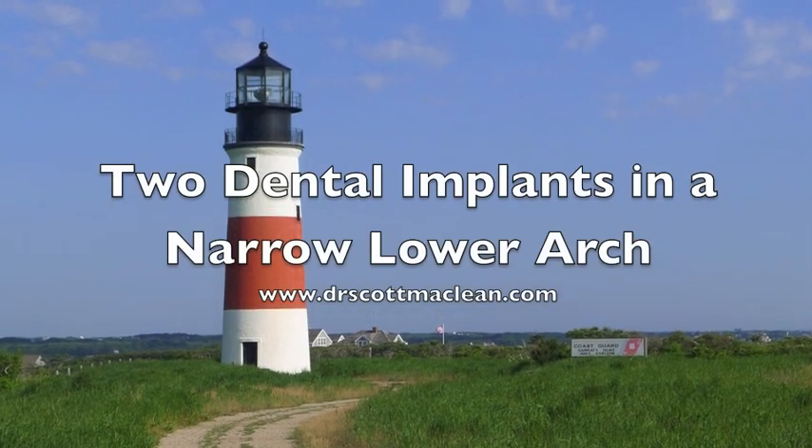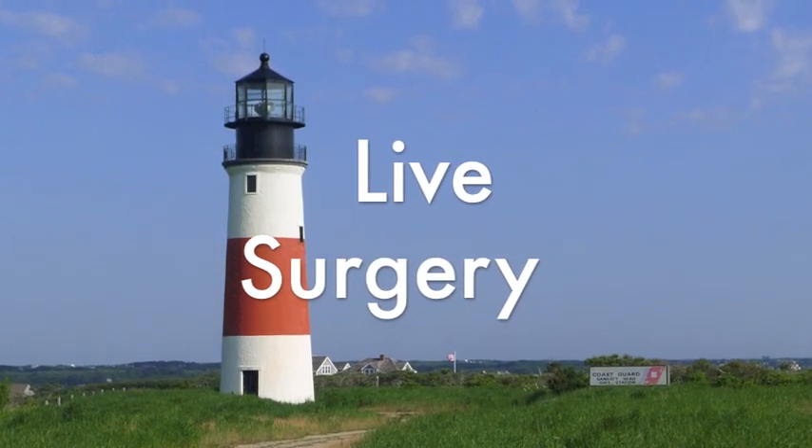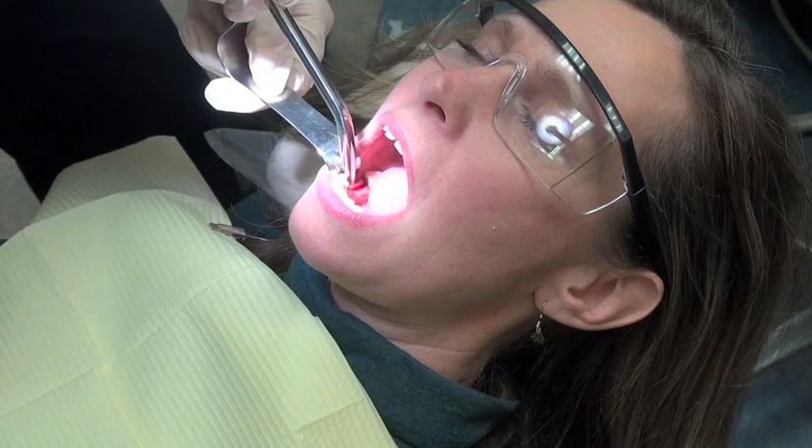This is Dr. Scott McLean and this is a YouTube video about dental implants. Today's patient is a female who has a lower bridge that had to be cut out and she lost an anterior abutment.